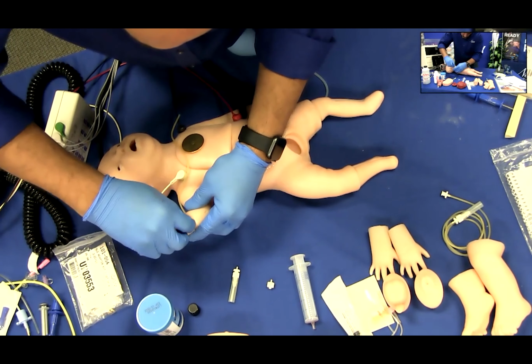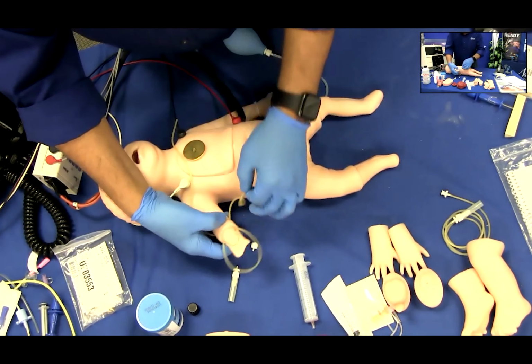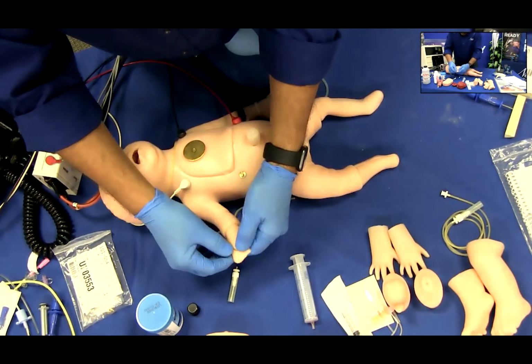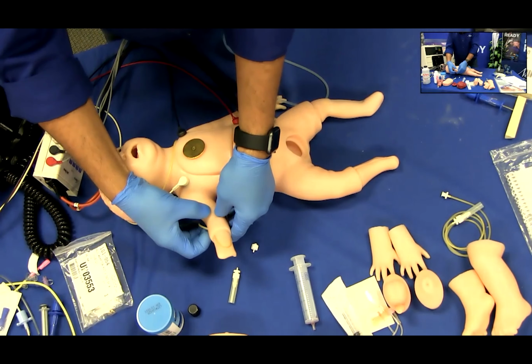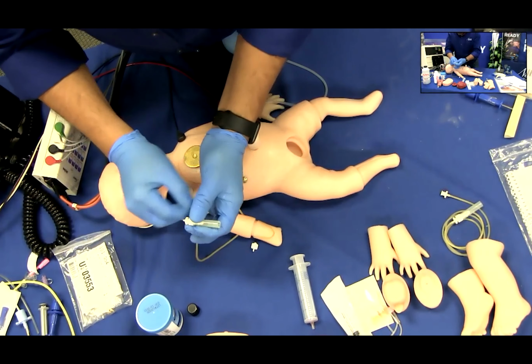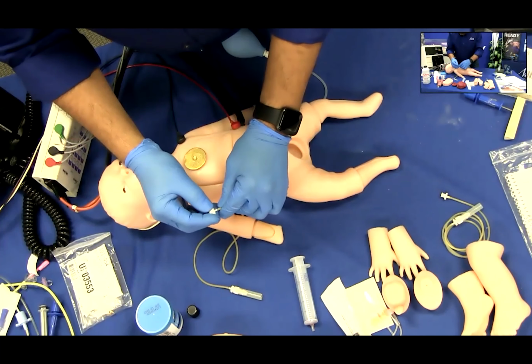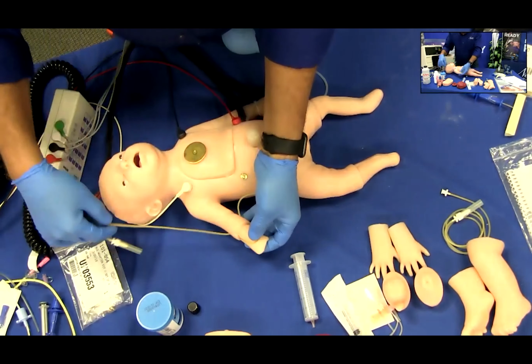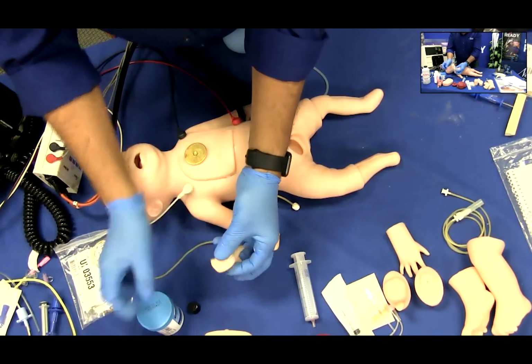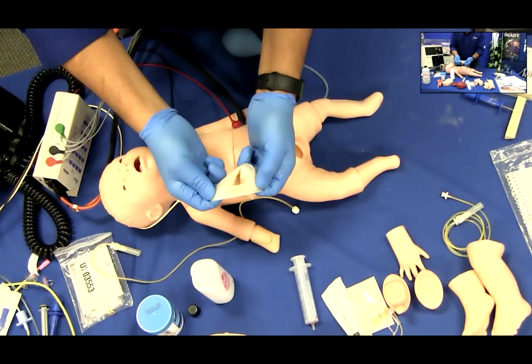From the medial side of the vein channel, feed the tubing through the remaining hole. Adjust the tubing so that it lies securely in the channel. Attach the luer fitting to the open end. Generously powder the inside of the hand. Gently pull the skin over the hand, taking care not to dislodge the vein tubing.